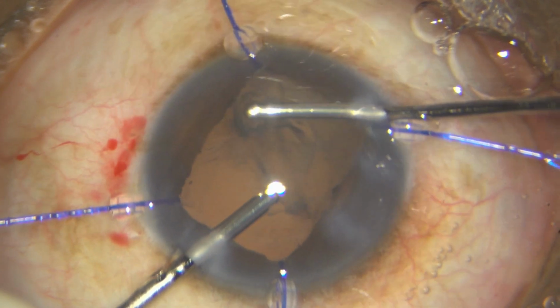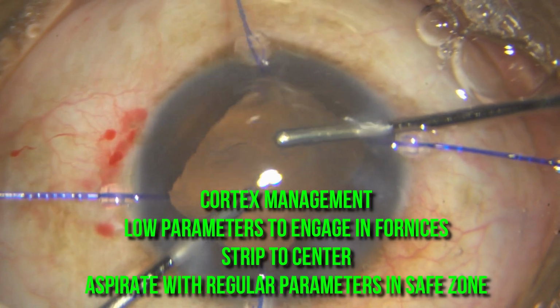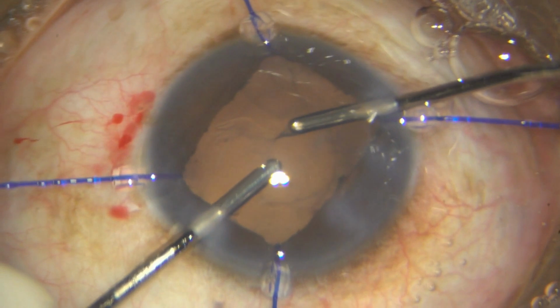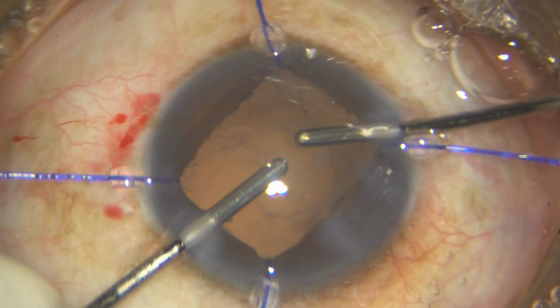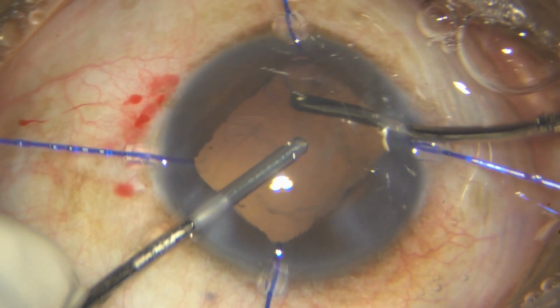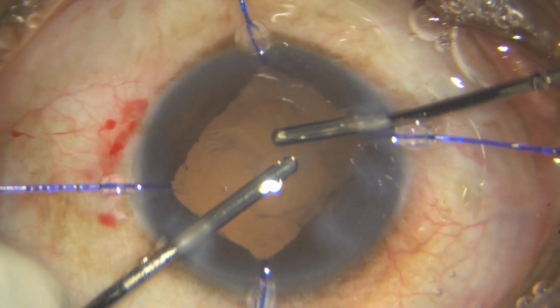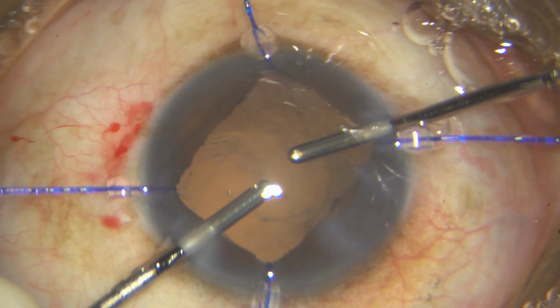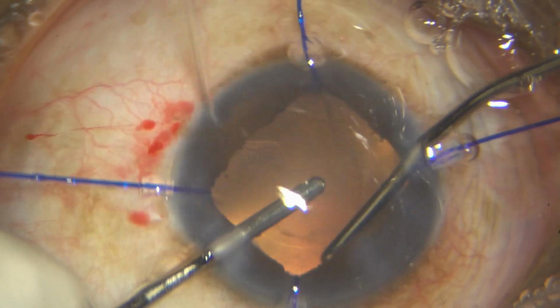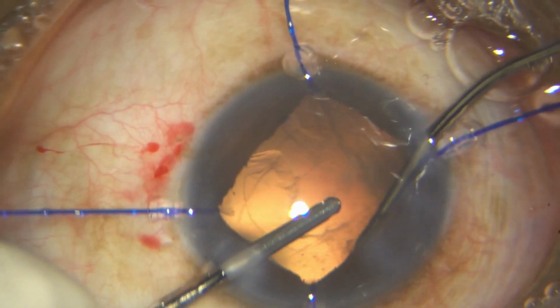I have to switch between my parameters often. When I go into the fornices, I'm going at very low vacuum and outflow, just engaging the cortex, bringing it to the center, and then increasing my parameters for aspiration. Because if you just watch how that capsule is almost dancing, I can easily get that into my port if I'm not careful. And the capsule doesn't look too strong either.